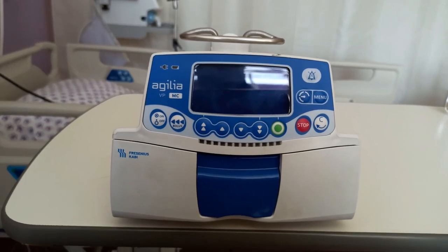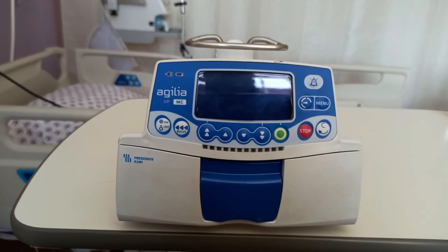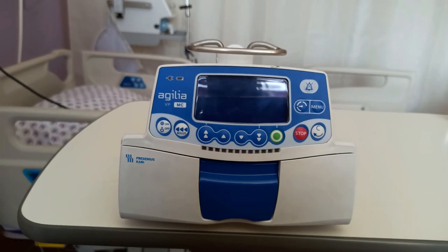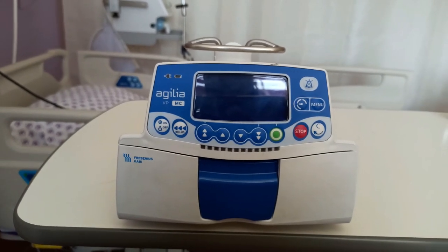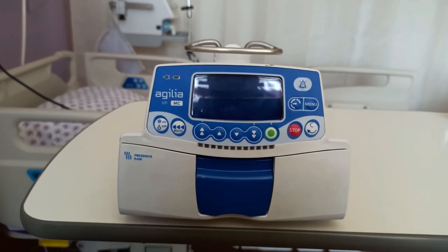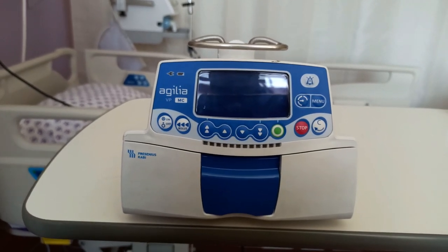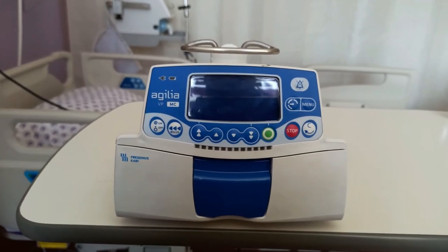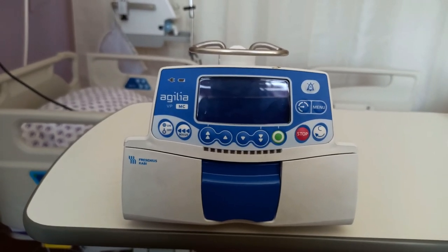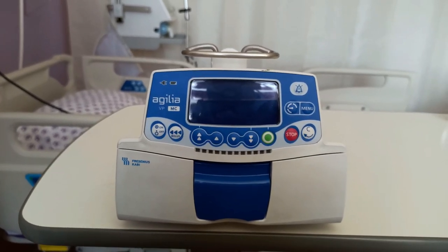First, we will take a look at the physical aspects of the infusion pump. Starting from the front, we can see the display and an array of buttons and LEDs. On the leftmost part is the power button, which will turn the equipment on and off. Towards the right is a green button used for starting an infusion or validating any changes. The stop button will stop the infusion, the C button will clear any changes, and the four navigation buttons in the middle are used to change values or navigate through the menu.